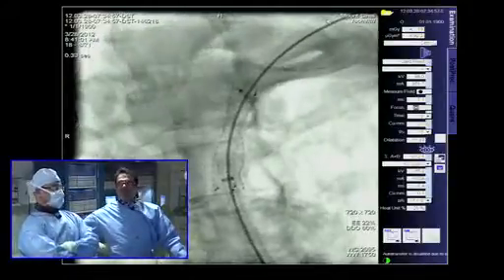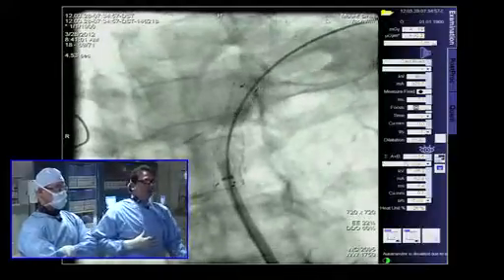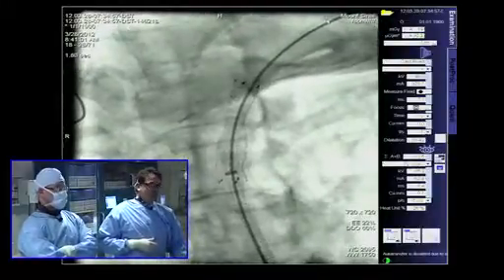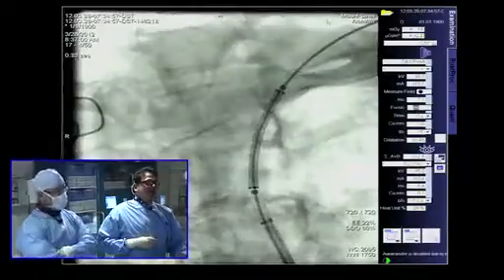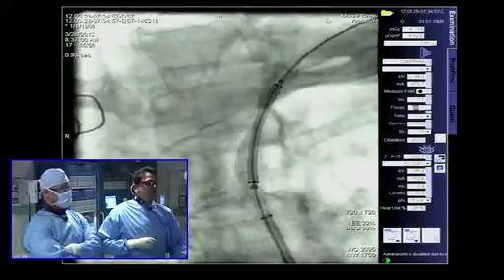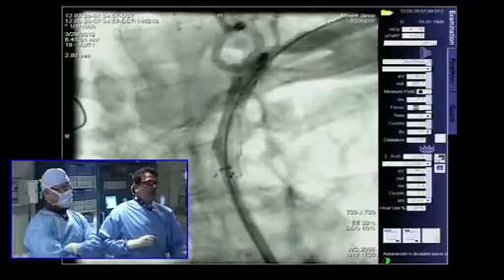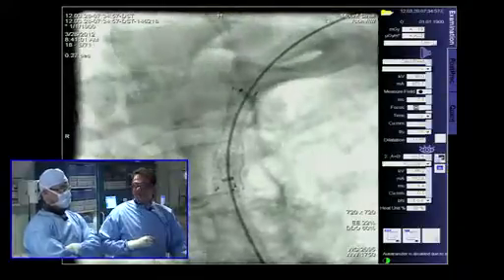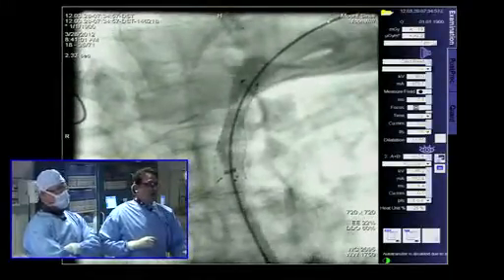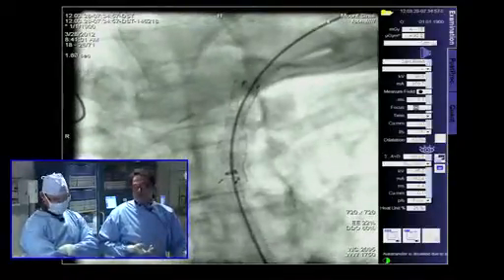Now, as far as this gradient that we're concerned about, this is an 8mm stent. We went with an 8037. Well, it was an 837. Yeah, it was an 837. And you can see we have a nice expansion and a little bit of a dent. Now, you could go crazy and go ahead and balloon it, which we may, and I think we'll discuss that. Or we could check a gradient and see whether we have a gradient, and if there's no gradient, we're done. I think that's what I'm going to do.